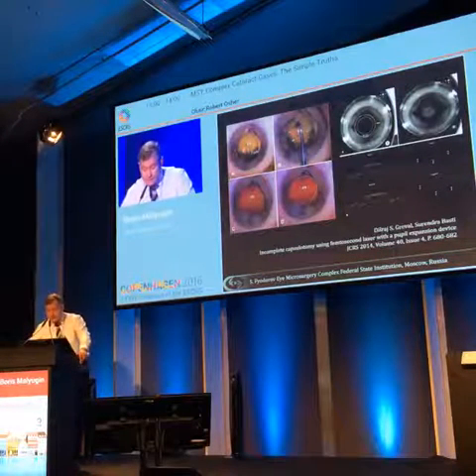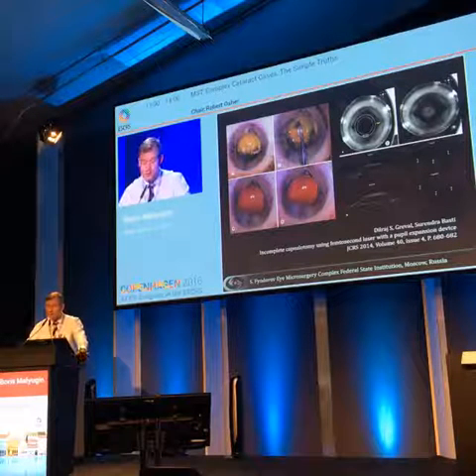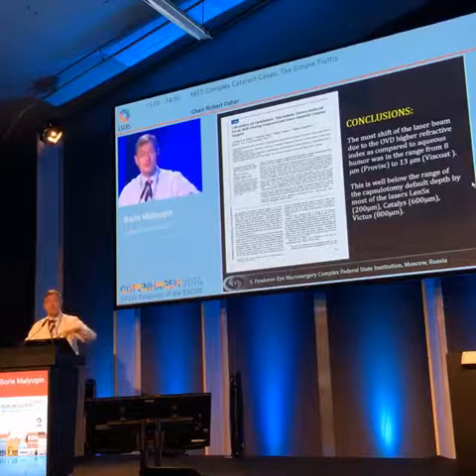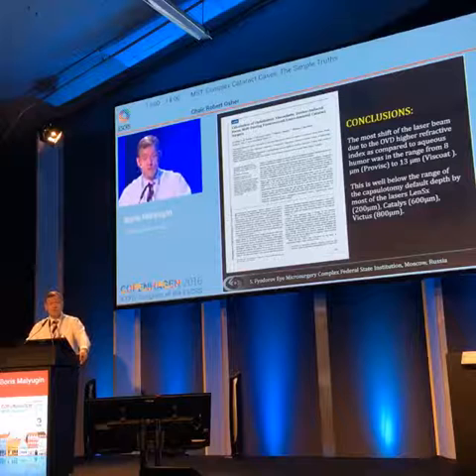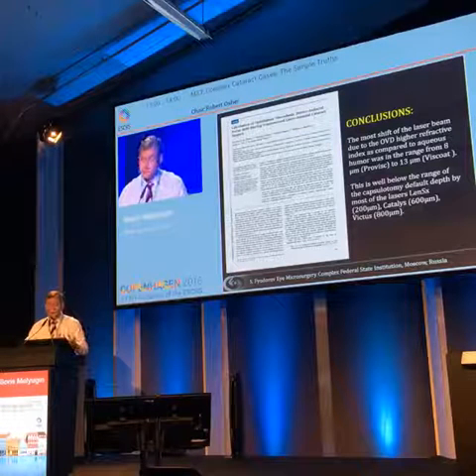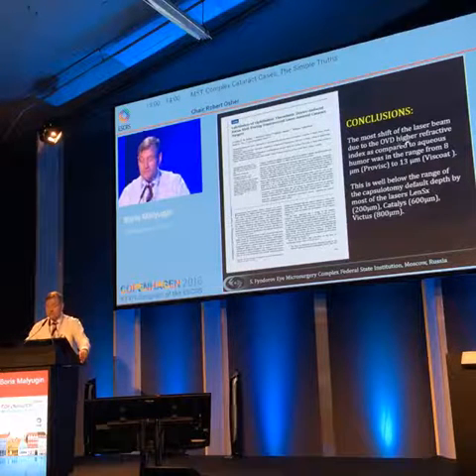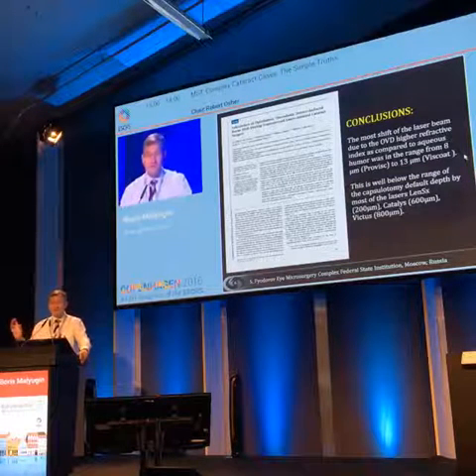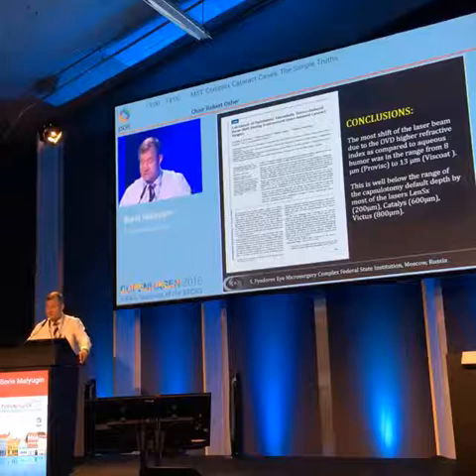To summarize, there are some publications of using this device in the literature, and there were some reports regarding incomplete capsulotomy related to the viscoelastic that was left in the anterior chamber, which is a little bit contrary to my personal experience, because with the combination of chondroitin sulfate and sodium hyaluronate, we never experienced any issues with complete capsulotomy. And we know that OVD, even having a higher refractive index as compared to the aqueous humor, does not really deviate the laser beam much, and it is within the range of the capsulotomy that we would love to have.